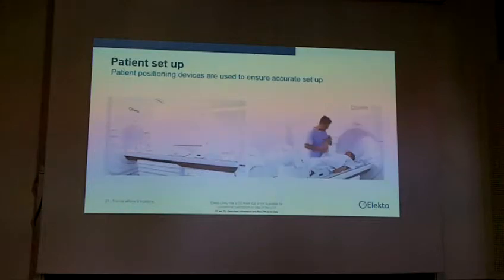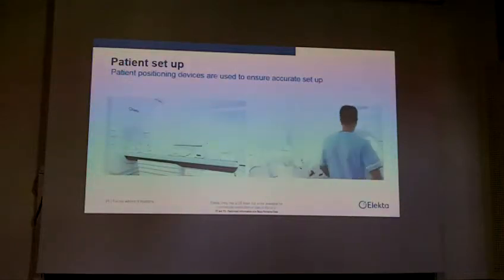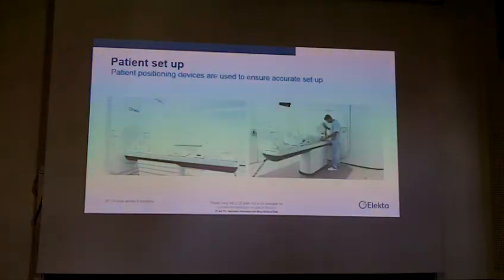Then the patient is moved into the bore in a predefined position. I will go on because the time is very short.